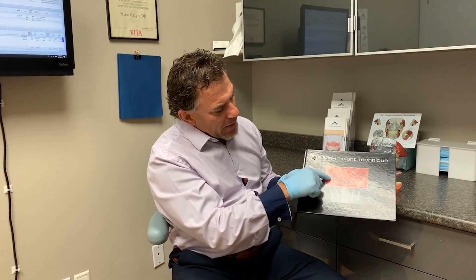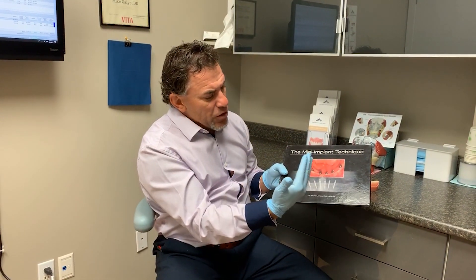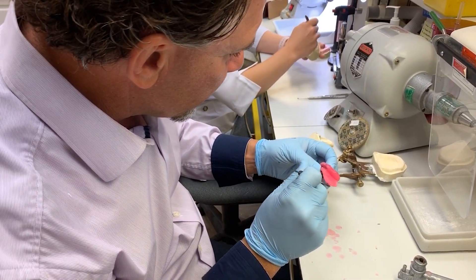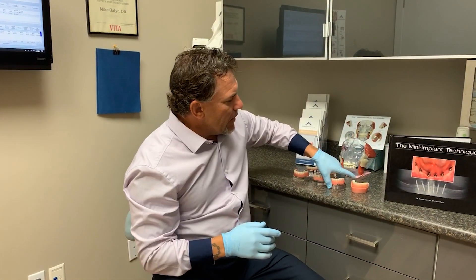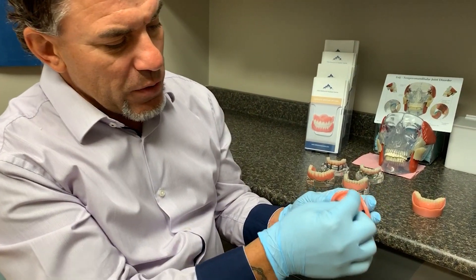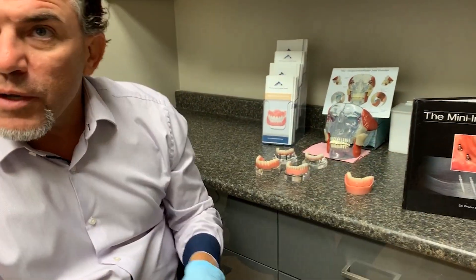Once the implants are placed, it takes about a week or so to let them heal and settle. What we then see in the mouth are these silver posts. The advantage is it's quick, easy, and cost-effective. It uses a little O-ring type system that attaches to the implant. Inside the denture, there's a little housing with a rubber O-ring that attaches to the O-ball poking through the tissues.